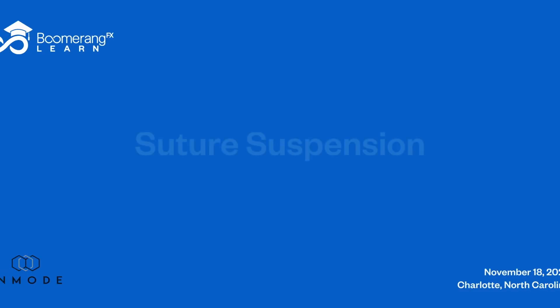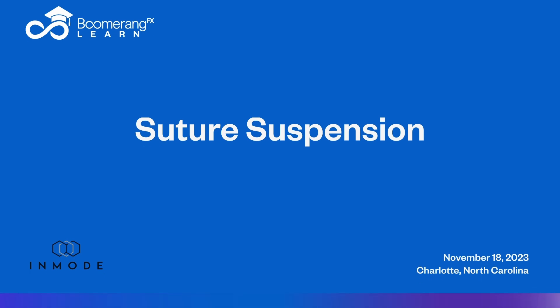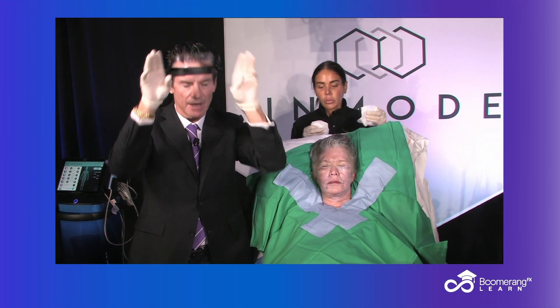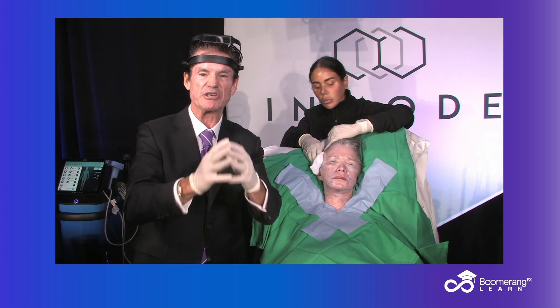Again, sterile technique. We haven't changed — I wouldn't have changed my gloves, I would have done it all at once — but now we're in our last phase. Welcome back to Charlotte, North Carolina. We're in the last phase of our suture suspension facelift.